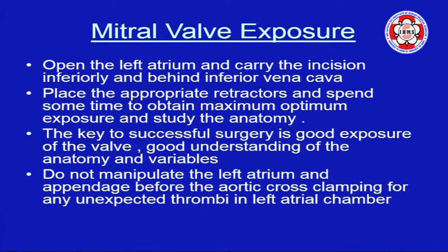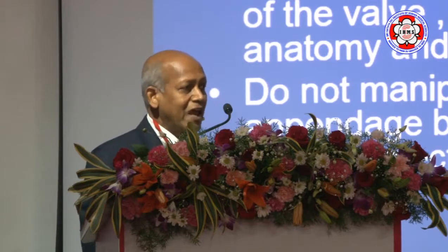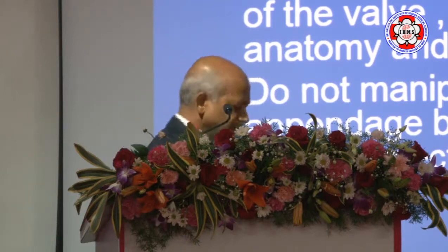I've seen, not only here, even in the US, people put the retractor and they want to start cutting the valve. Spend a little time. Look at the anatomy. Do you have adequate exposure or not? Is the valve disease repairable? What happened to the subvalvular apparatus? Most people don't look at any of those things. They just go to the valve and cut the valve out. Spend some time.